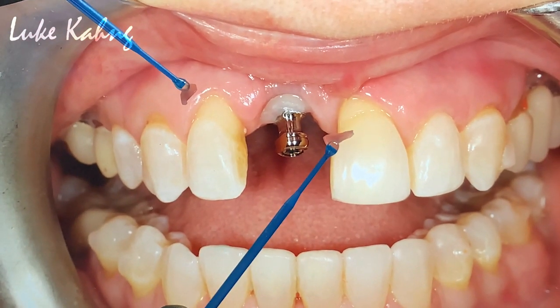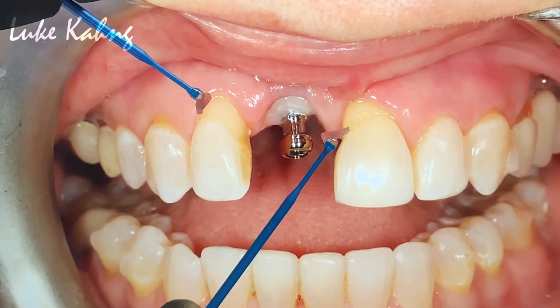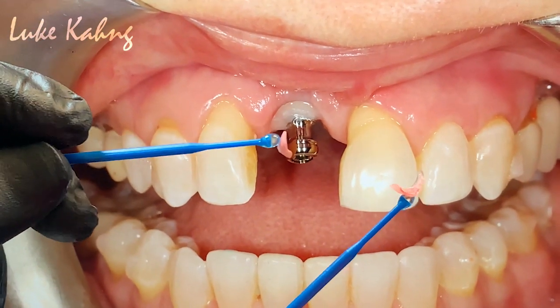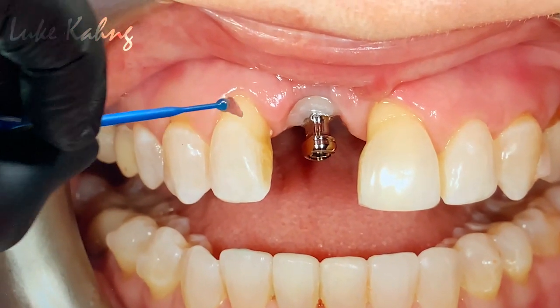Today's case, I think it's a very difficult case, which is Dr. John Vargas in New York. He liked this patient so much, so we did it today, which is a pink porcelain to cover that area, and then this pink porcelain covers that area.